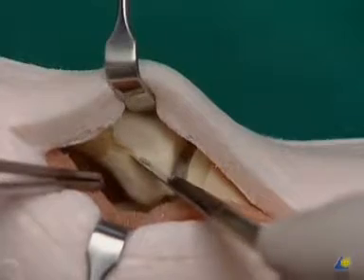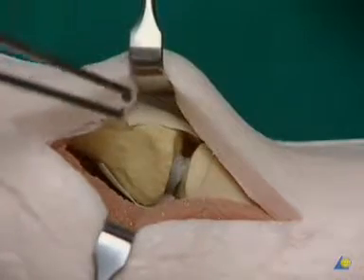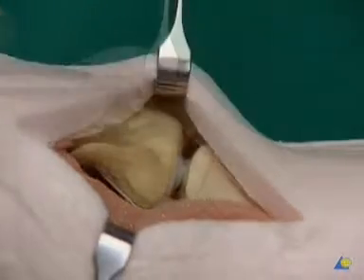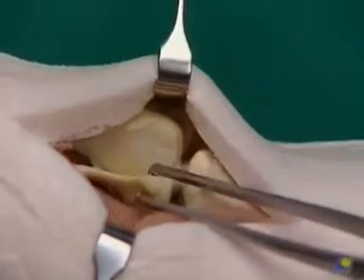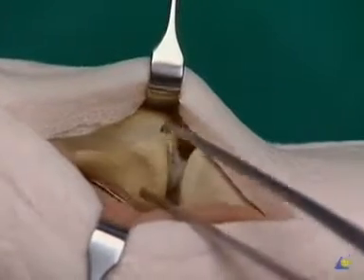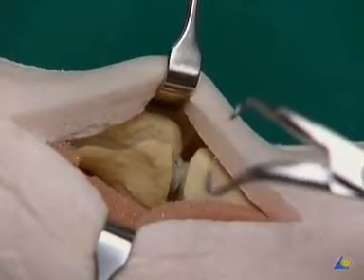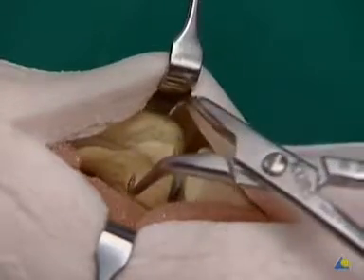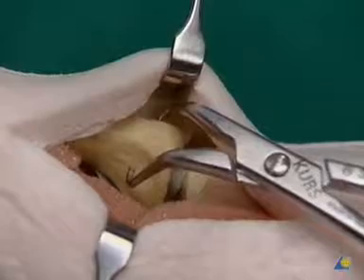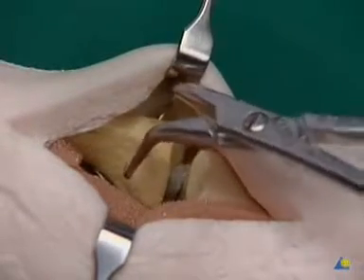The periosteum is split with the scalpel and retracted in the dorsal and palmar directions. After exposure of the fracture, the Bennett's fragment can be moved aside with tweezers. The fragment is then reduced and held with the small reduction forceps, producing a smooth articular surface.